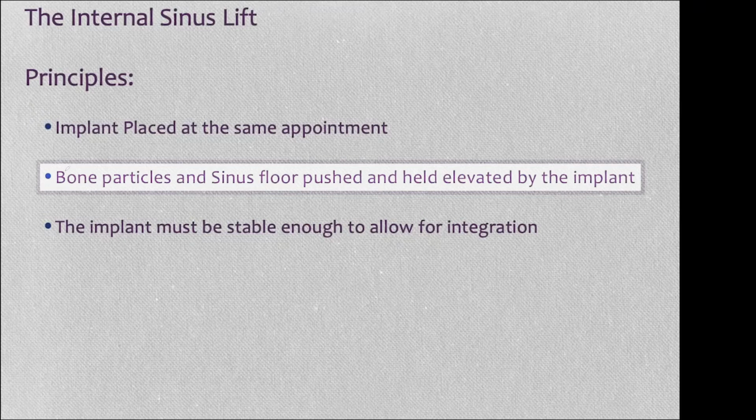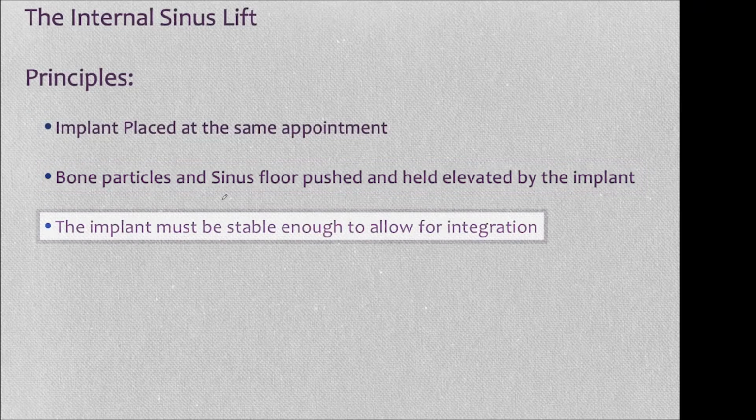However, the bone grafts are not just a graft. They function as a surgical instrument. And I will elaborate on that in a little bit. But suffice it to say, I am a fan of using them, especially the fine particle size, and especially making that fine particles into a slurry, like very wet, near viscous liquid, okay? And that will help us complete the treatment. It is very important, however, that the implant be stable at the end of the procedure so that it doesn't move and cause perforation, dehiscence, herniation, and most likely failure of the graft because of the constant movement.